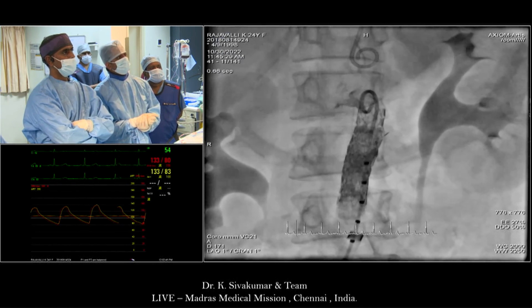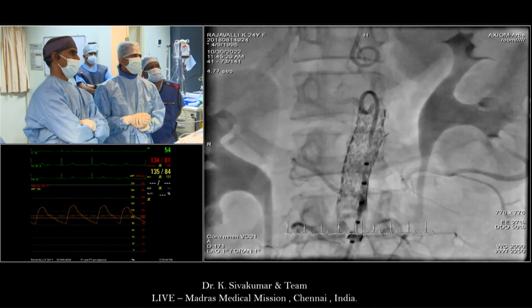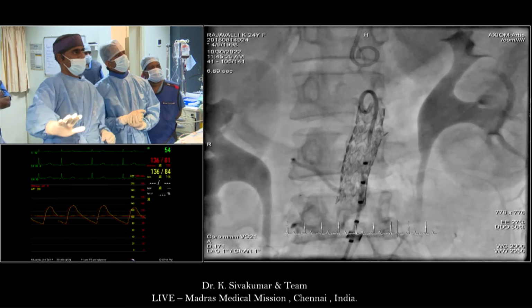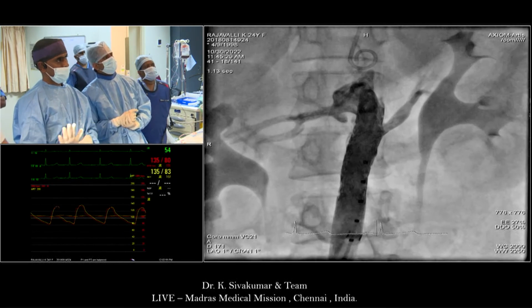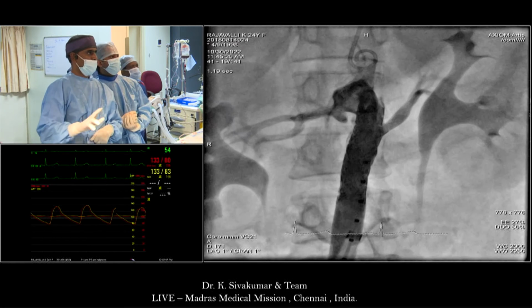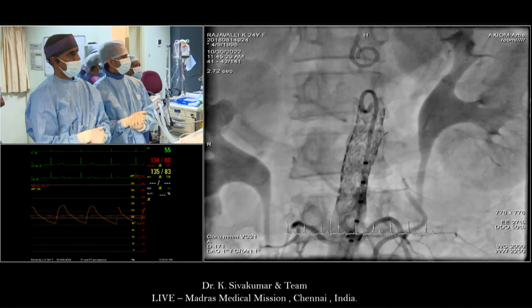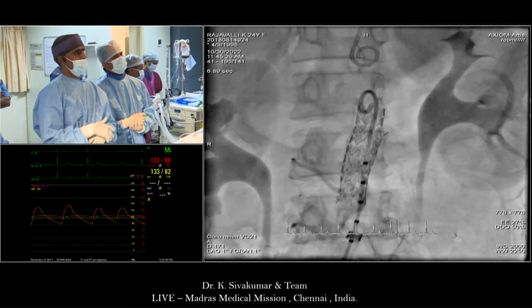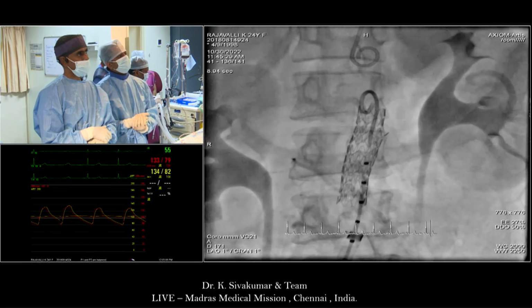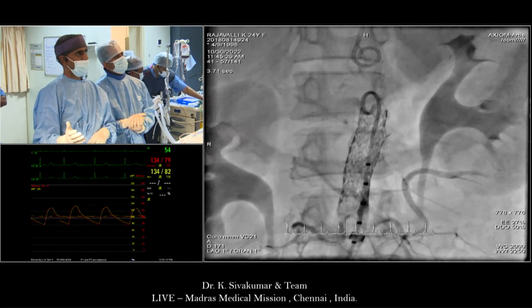Next. So we took out the guide wire and we put in a pigtail. Freeze this when the angiogram is fully filling the aorta. Freeze it. So the renal artery is open. Keep on running forward. So the aorta looks good enough. Run it again. Freeze. Freeze.